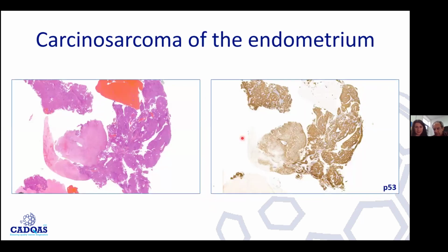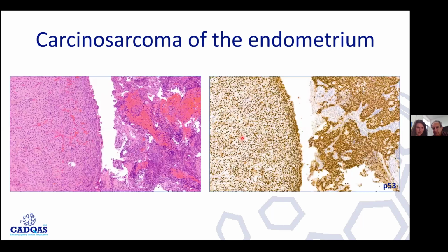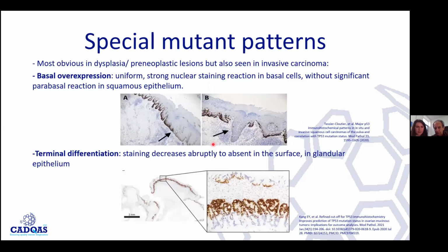And this is actually a case from this morning that I had to check for molecular NGS studies for POLE. And this is actually carcinosarcoma. So we have the endometrial component to the right, and then the sarcomatoid component. And this is the most aggressive. But we can see that the mutation is throughout. So again, another missense pattern. I didn't have examples of other patterns in this.